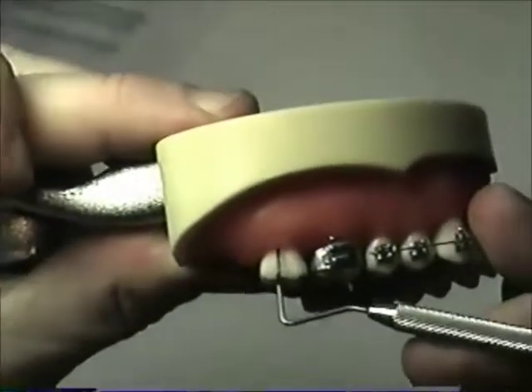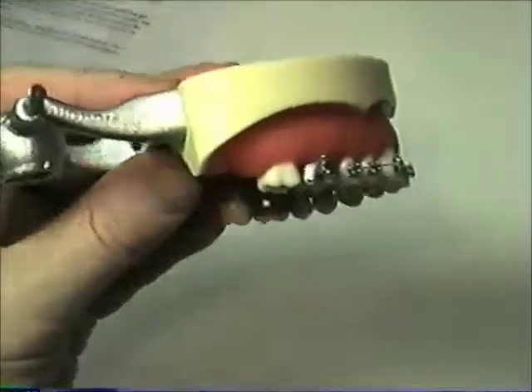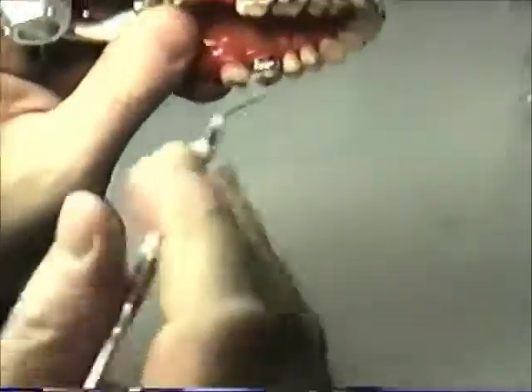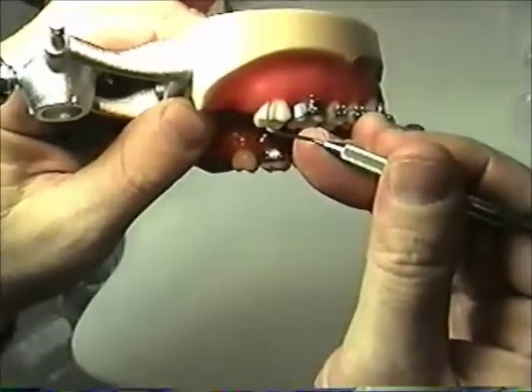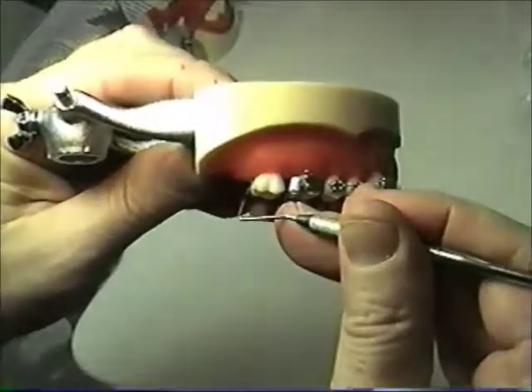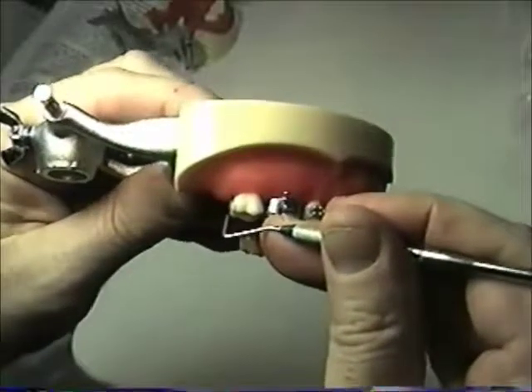Again, you can see the probe, it goes up under the gums. See right here, it's going up, there's the black. And then right back here, you can see where the gum just drops on in. Now I know this is going out of focus real quick here. Let me see if I can, there we go. So the probe goes up under those gums. See where this is? But if it ever drops in an area like back here, it drops way up there. Oh my gosh, that dropped in there way up in that black.